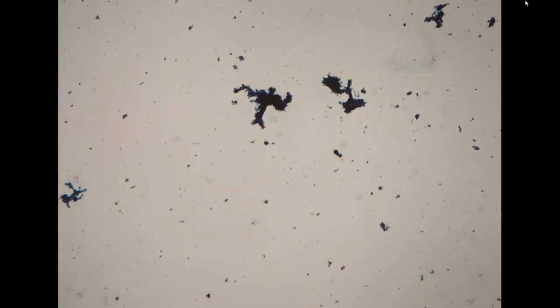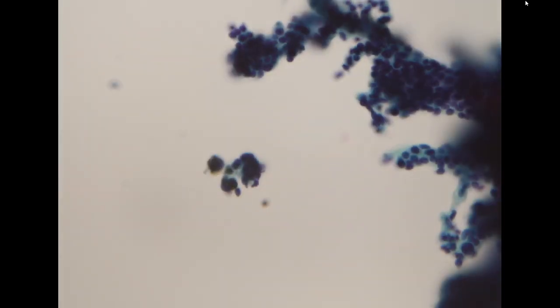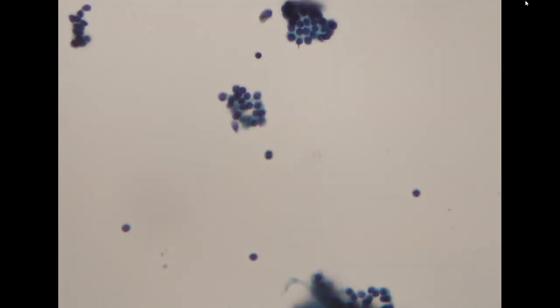It is very unusual to see this type of very three-dimensional, papillary growth fragment in a thyroid specimen. Particularly, there are no nuclear features of PTC.